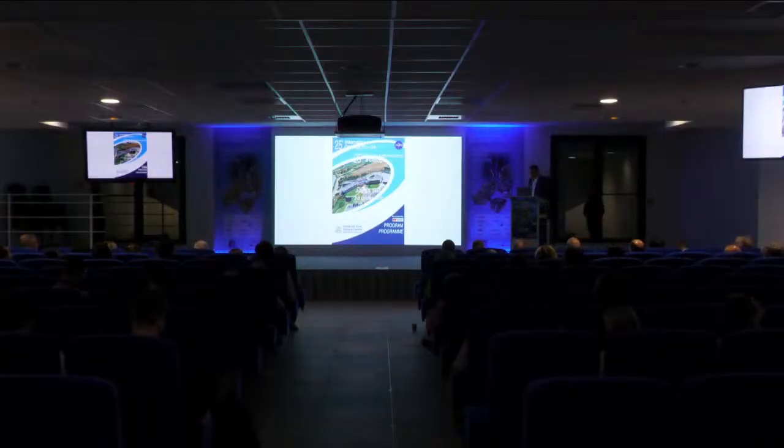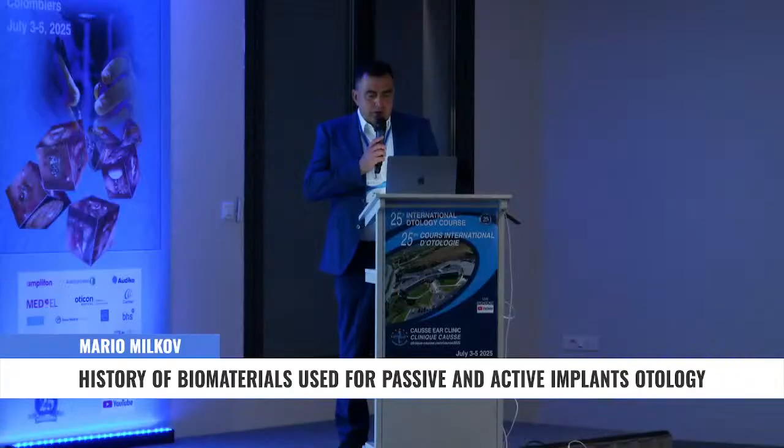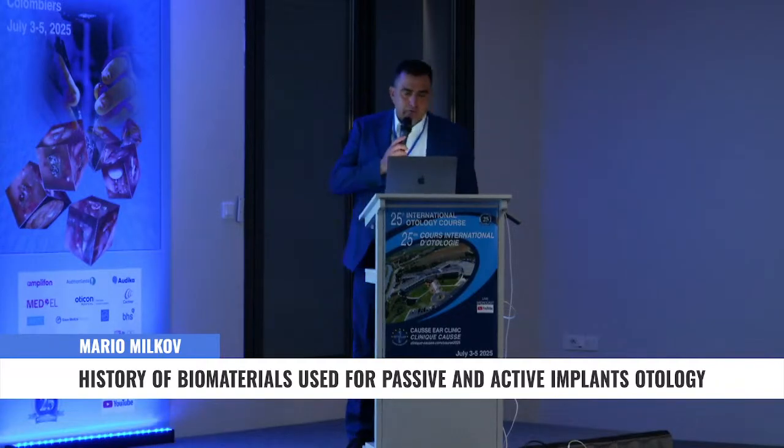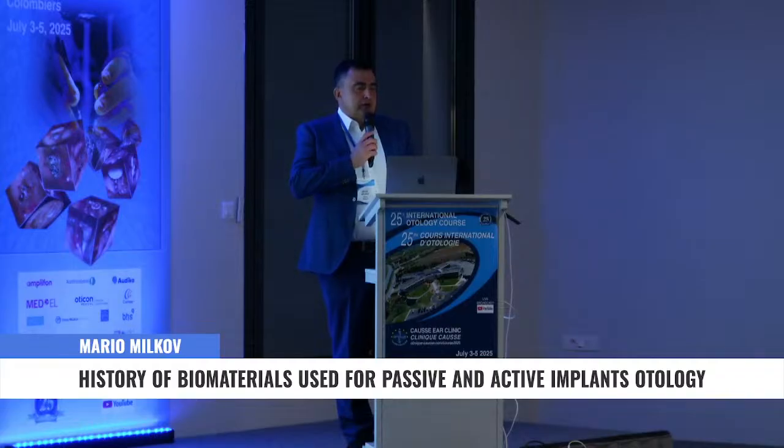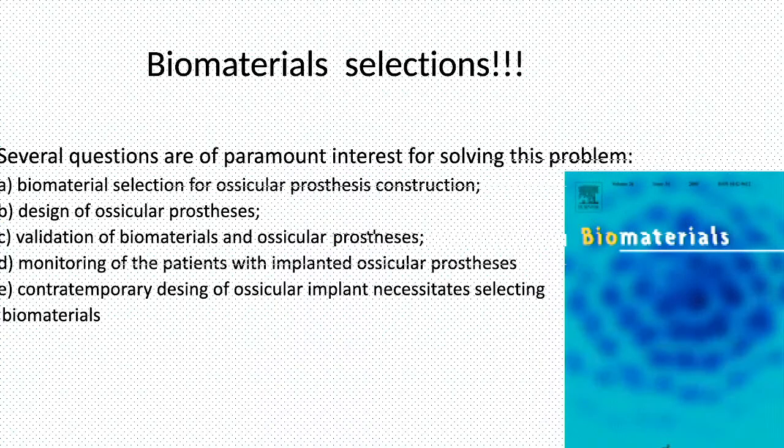For 2 wonderful days. And my topic since 1999 is biomaterials. You know, biomaterials are very important for physicians, for any specialty, not only for ENT doctors. The biomaterials used for reconstruction of the ossicular chain must present a good degree of biocompatibility and biostability. Most must become osteointegrated with minimal risk of ankylosis. Several questions are of paramount interest in solving this problem.